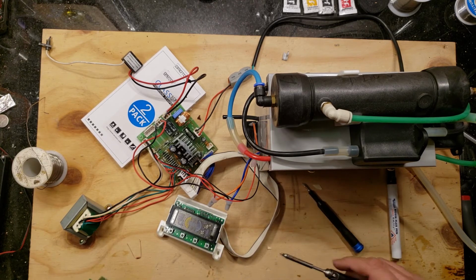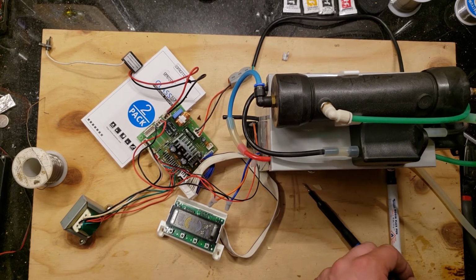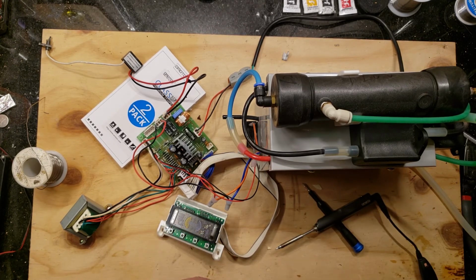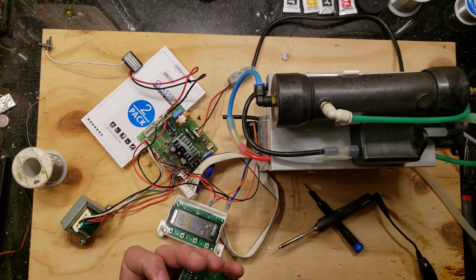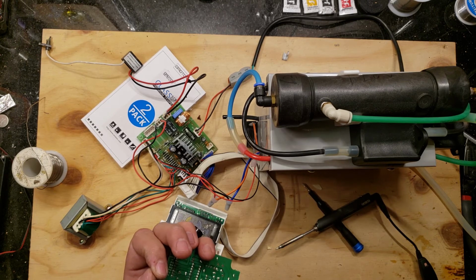When the leads are bent like that, it doesn't want to come out. So let's see. Let's make sure this doesn't have too much solder on it. It's not good to grab the soldering iron with your bare hands. You can end up with a burn. Oh, there's another resistor that's been clipped. I wonder what that does. I don't know if I'm going to test that or not. Everything seems to be working.